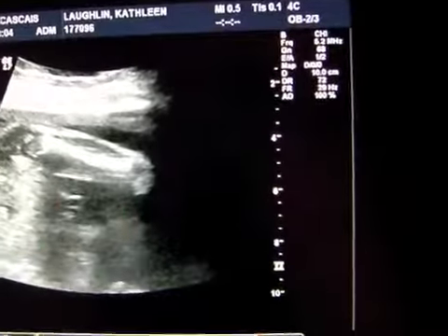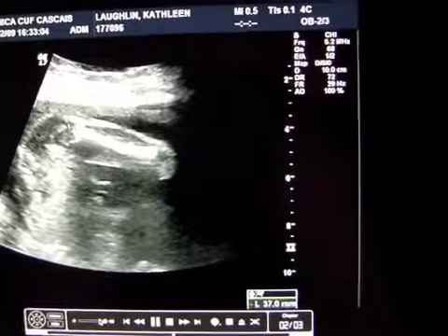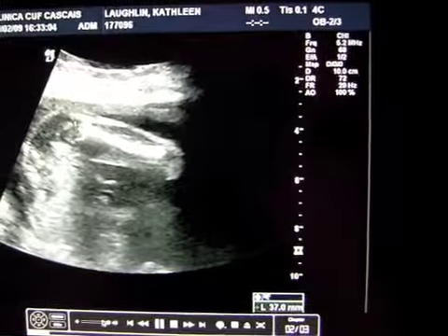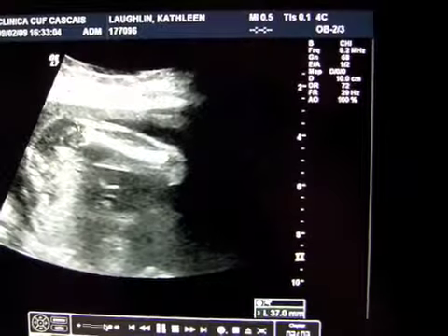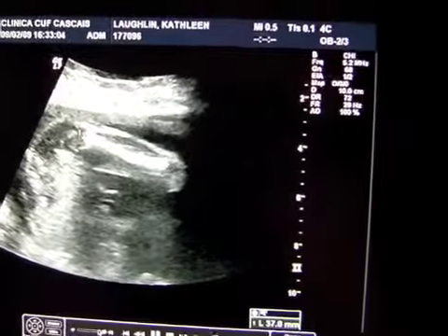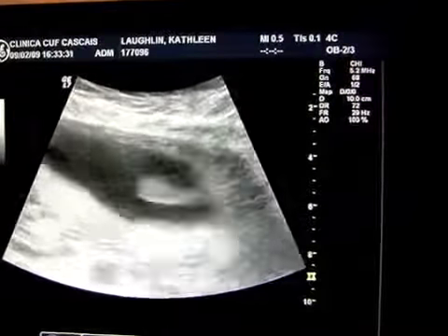So we started moving down her body. We started with her head, and then her abdomen, and checked blood flow and oxygen flow. And now he was measuring her bones in her legs. So this is a measurement of her femur bone, and I guess quite similar to her stomach. He thought this was a long measurement. He sort of went, whoa, she's got long legs. So I guess no surprise there.